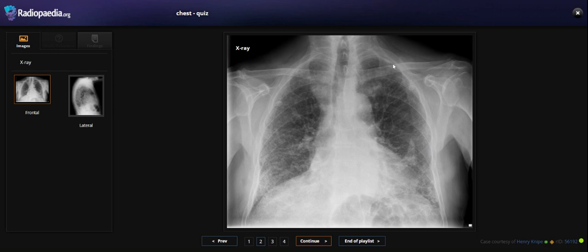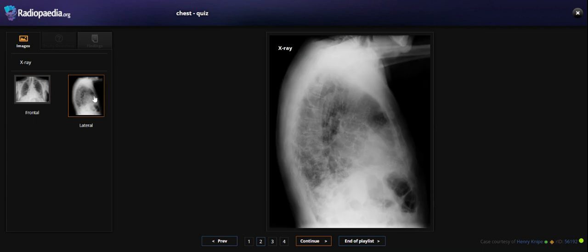We note the calcified pleural plaques mostly on the left side. In the left side lateral view also, the findings are the same as in the frontal view.